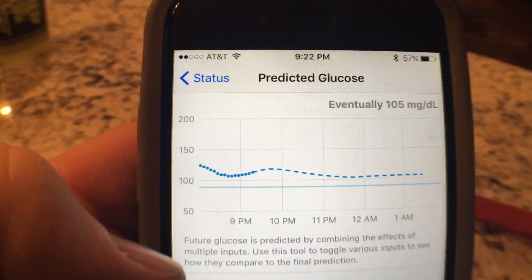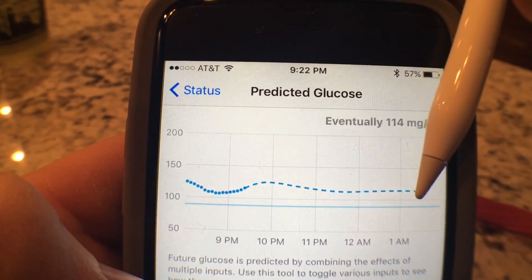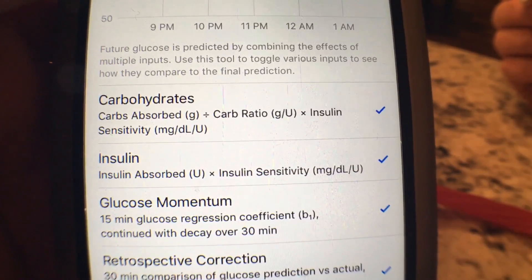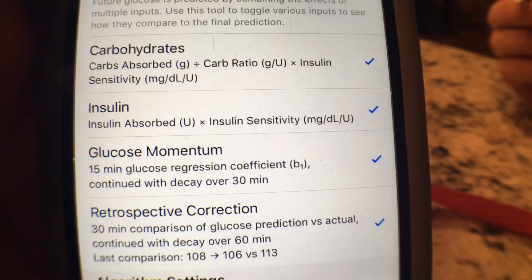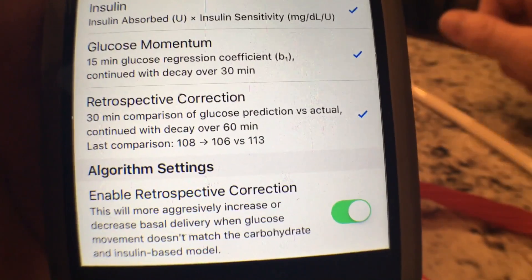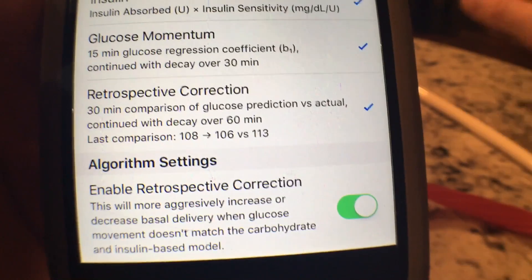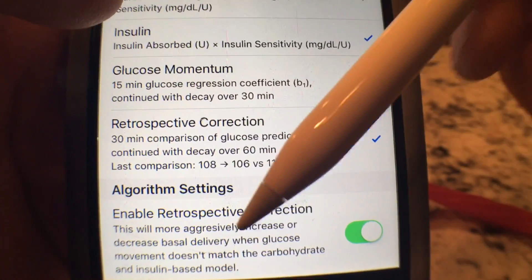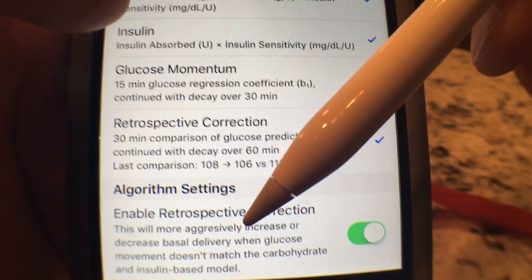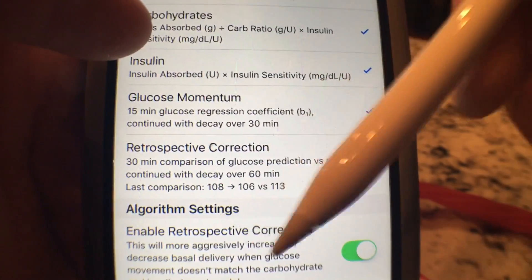When you tap in here for glucose, it will show you your predicted glucose. It says this hash point says it is eventually going to be 105 — it just changed to 114. This is the algorithm that the app is running in the background: carbs, insulin, glucose, momentum, and then retrospective correction, which means it can aggressively go back and notice that when your glucose movement doesn't match the carbs and the insulin that you have, it's saying wait a minute, you need a little bit more. Maybe there were more carbohydrates in what you ate. So it can give you a little bit more based off of what you've eaten, not what you said you've eaten. This is basically a lie detector right here.